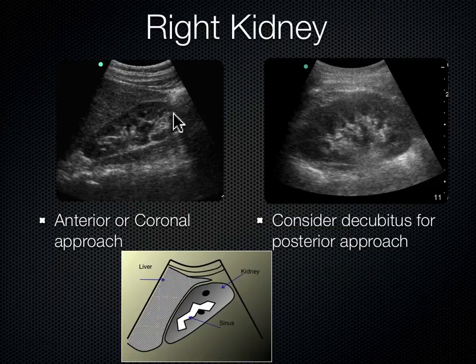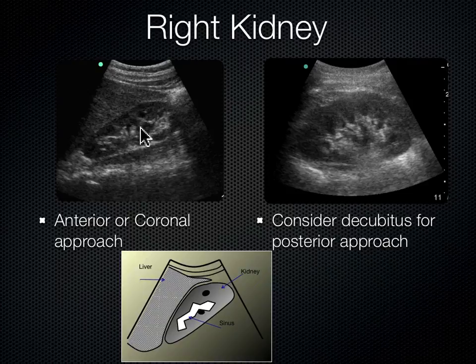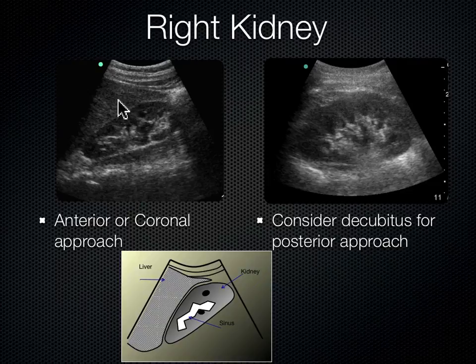The anterior or coronal approach uses the liver as a window to see the kidney. Going more posterior, you can see the psoas muscle behind the kidney — it lies right on top of the spine. So from posterior to anterior: spine, psoas, kidney, liver. You can identify the upper pole more towards the head, the mid pole, and the lower pole.